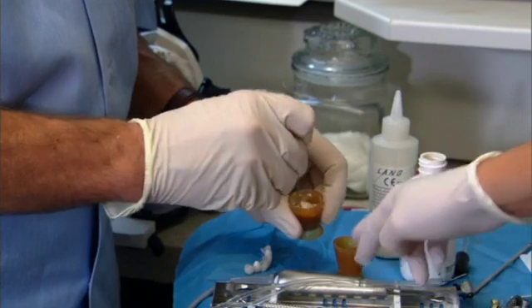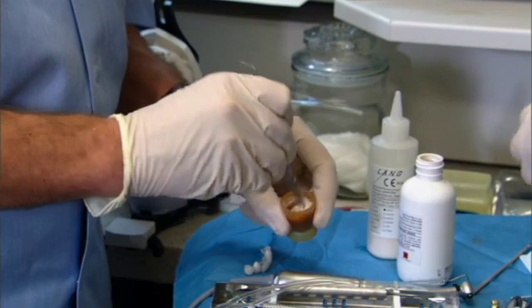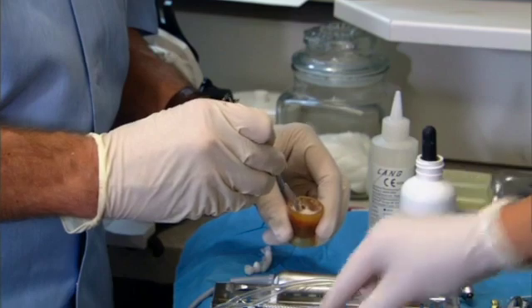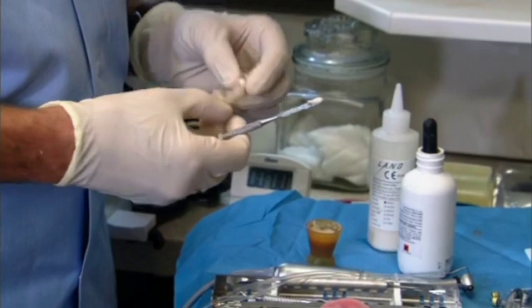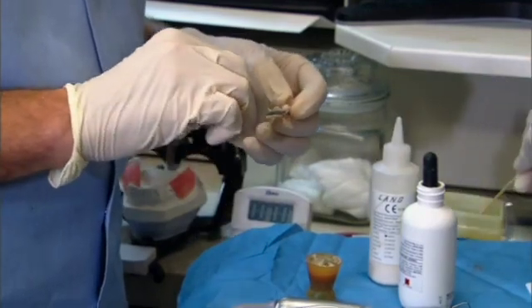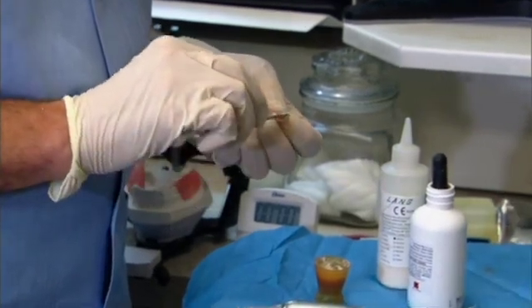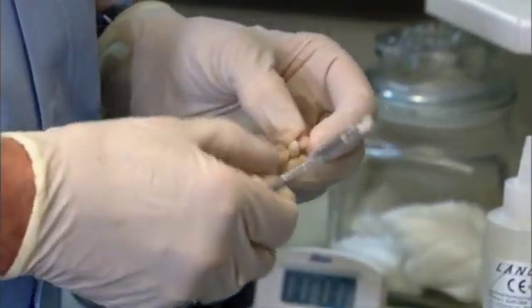These provisionals fit so well. The laboratory's just done a marvelous job of making them almost to my preps. There won't be a whole lot of acrylic necessary in these to fill in any gaps. So I'll just put a tiny bit in each one of the abutments. I have made a little vent hole in the lingual of these so that we'll let any excess out.